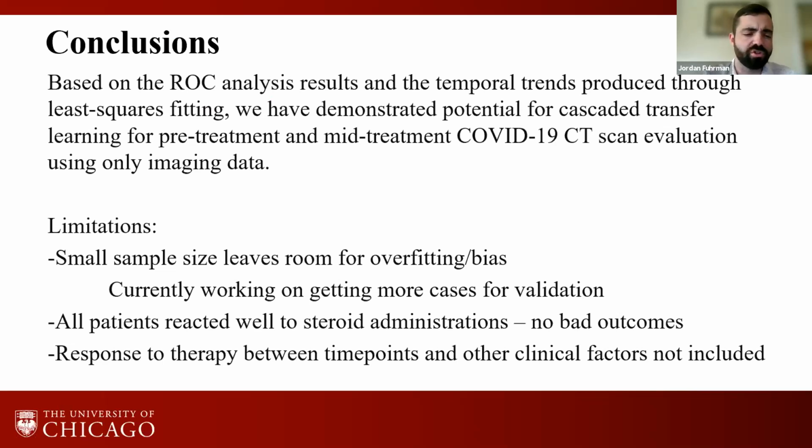I do want to quickly touch on a few limitations of this study. First off, we had a relatively small sample size. Obviously, this was from much further back in the pandemic, and so we've been currently working to validate this study on a much larger data set. Additionally, on a similar note, all of the patients in our cohort reacted well to the steroid administrations. So there were no bad outcomes or no deaths in our cohort. That's obviously something that we need to include to fully understand the generalizability of our model.